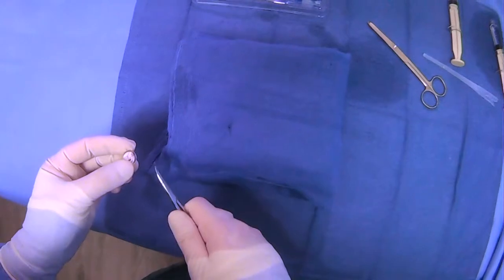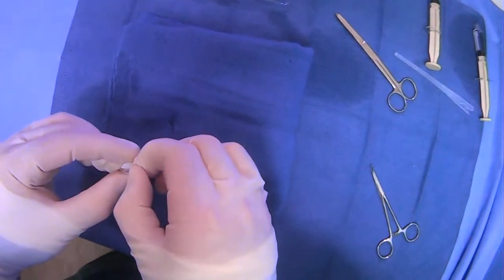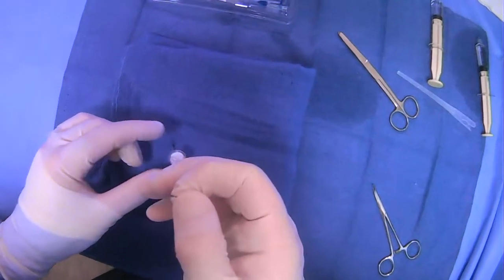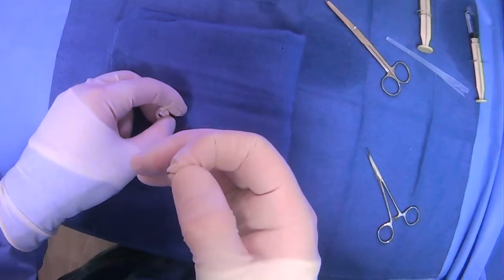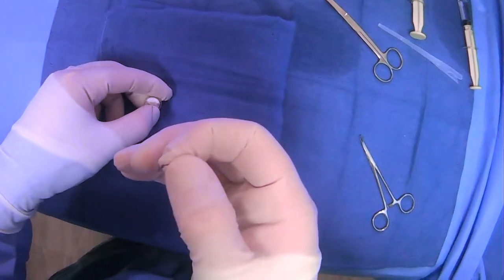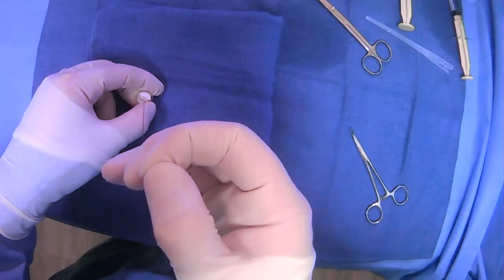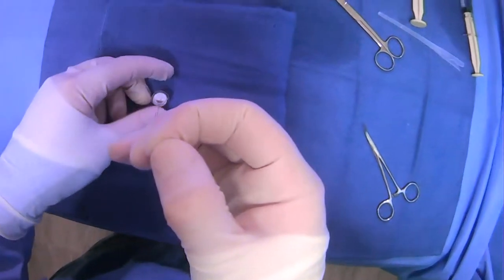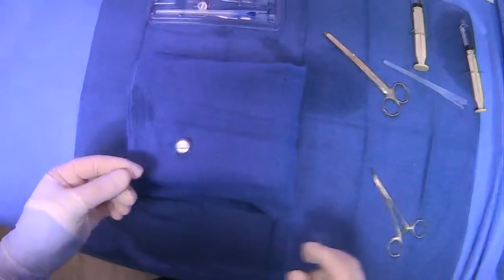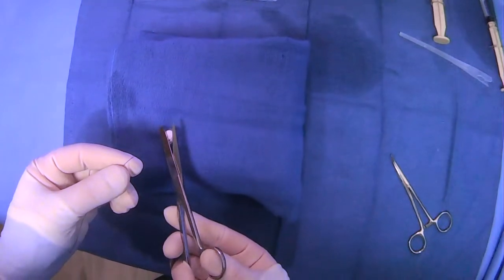At this point, we don't really need the clamp anymore, so we'll take the clamp down. And then what we'll do is slide down this button basically to the point where you can kind of tighten it where there's just a finger breadth underneath. And then at that point, you kind of clasp it into place. And then you can cut the suture off the top here.